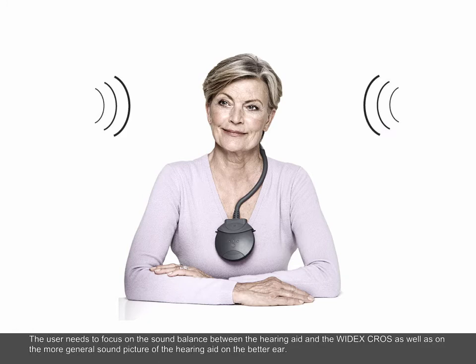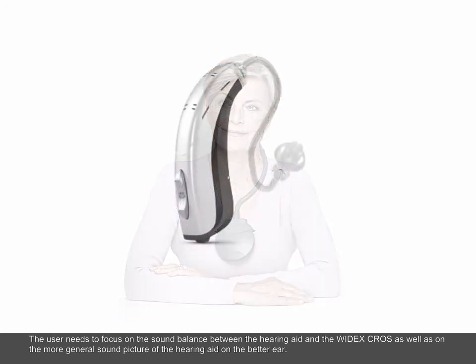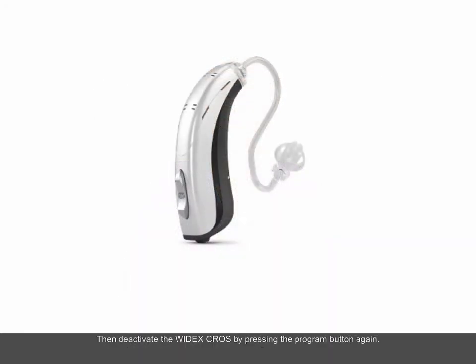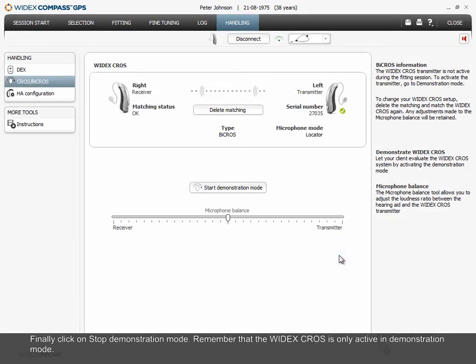The user needs to focus on the sound balance between the hearing aid and the Widex CROS, as well as on the more general sound picture of the hearing aid on the better ear. Then deactivate the Widex CROS by pressing the Program button again. Finally, click on Stop Demonstration Mode. Remember that the Widex CROS is only active in demonstration mode.